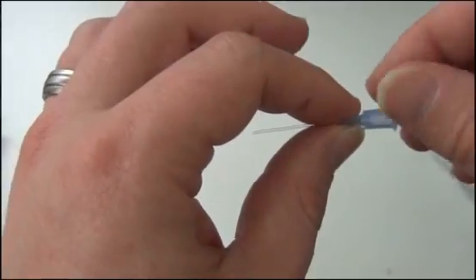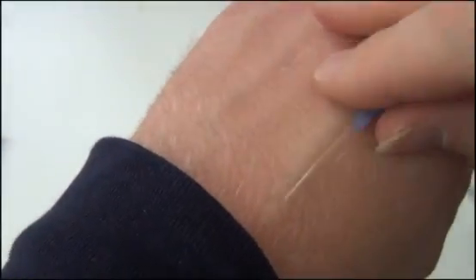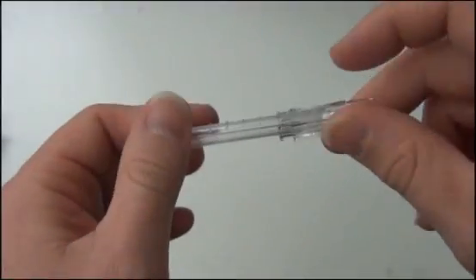So once you've done that, you'll connect that pigtail, that J-loop, and then you can tape it, secure it, and you have your IV in there, and that's it. And then this will be garbage, of course. Toss this away, and you're set. You have a good IV, you have it in there, and you're set to give your meds or your fluids or blood or anything.